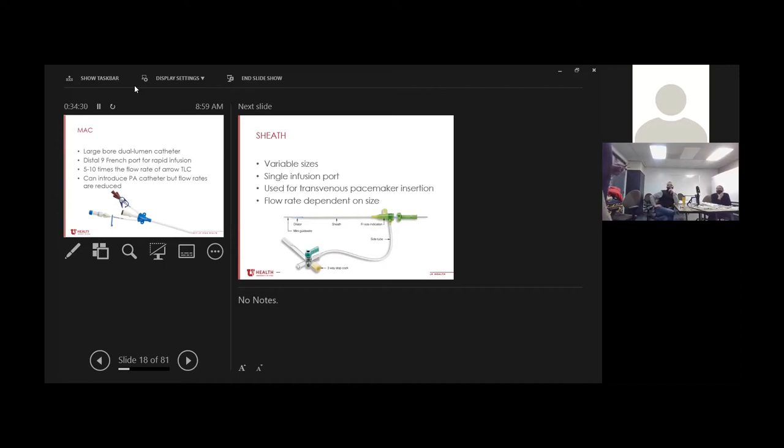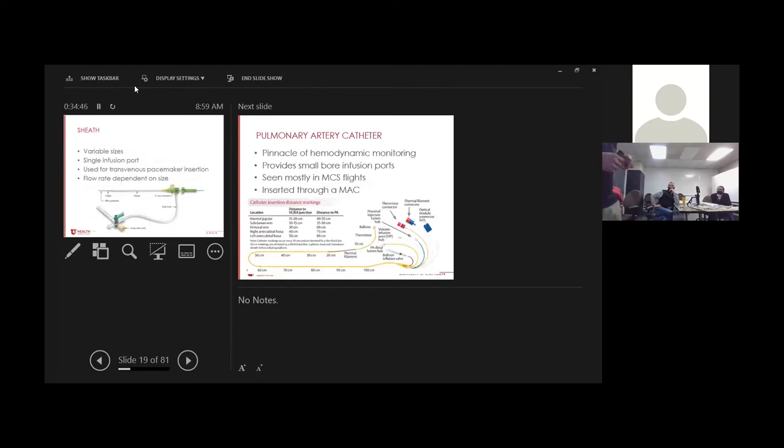When it's a fluid replacement function, at least our Belmont, we can get to 1,000 mils a minute, I believe. But that could be machine limited, not flow limited on a catheter. So it works really well. The Belmont will be that fast. It kind of illustrates the point, though it doesn't really affect us in this job. The other Belmont is for mass transfusion.